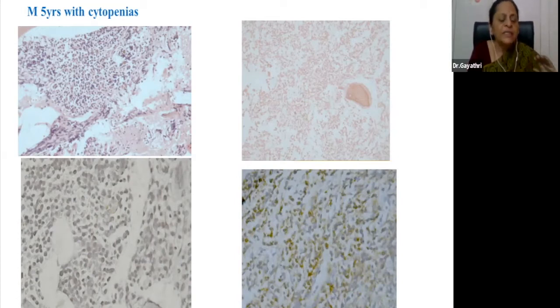I've dealt mostly with cells that look akin to agranulocytes, blasts. Okay. So in this case, now there is a leukopenia. In addition, there is thrombocytopenia, and therefore a bone marrow aspiration and biopsy are done.